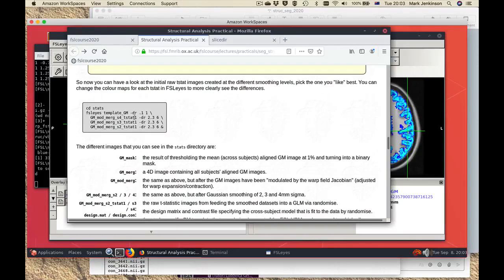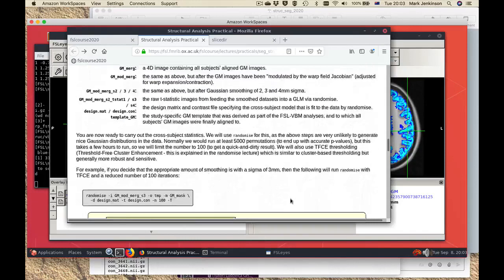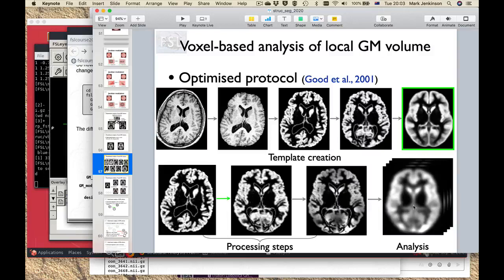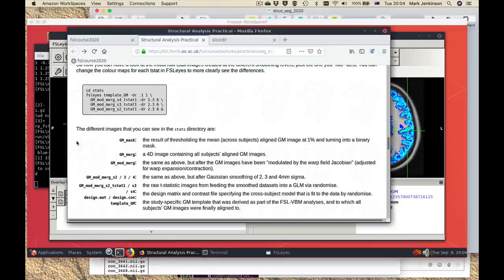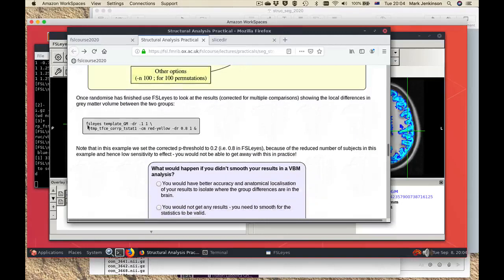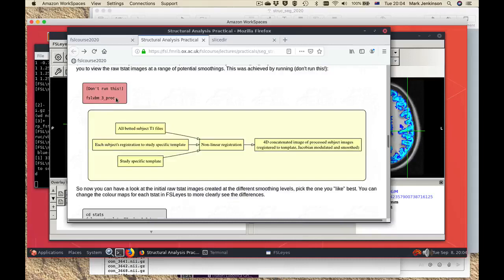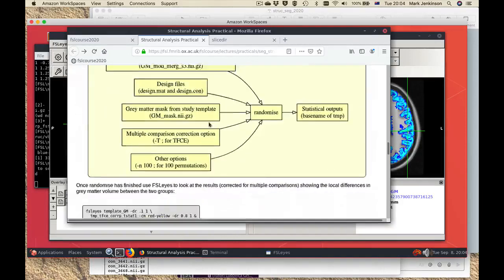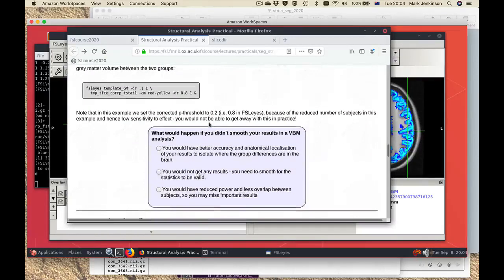As a consequence you get a number of different outputs which include different smoothing levels: S2, S3, and S4, representing two, three, and four millimetres of smoothing. There's a command to look at the differences from that. The result is simply the data we're going to feed into our statistical analysis, so the last thing we do is run the statistical analysis — again using the command randomize. That will allow you to run the analysis on the data created through the pipeline, and then finally an FSLeyes command to look at the outputs. As I said, you're largely looking at results which have already been created for you, but it shows you the different steps which would have been necessary to repeat that analysis. If you want to do it another time you can run those commands yourself from scratch and everything should work.